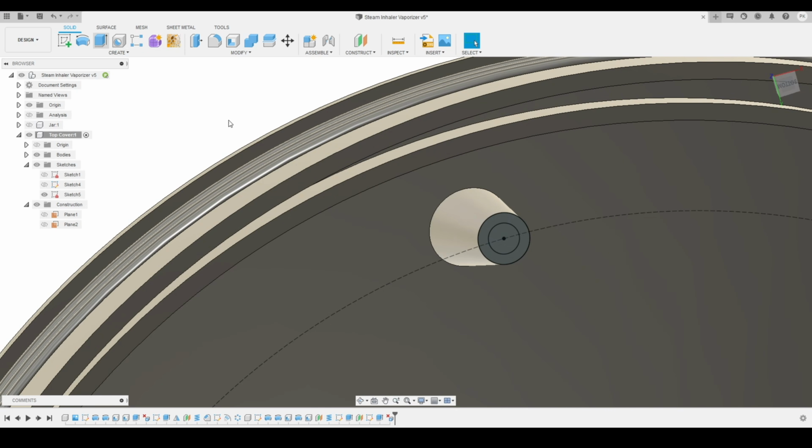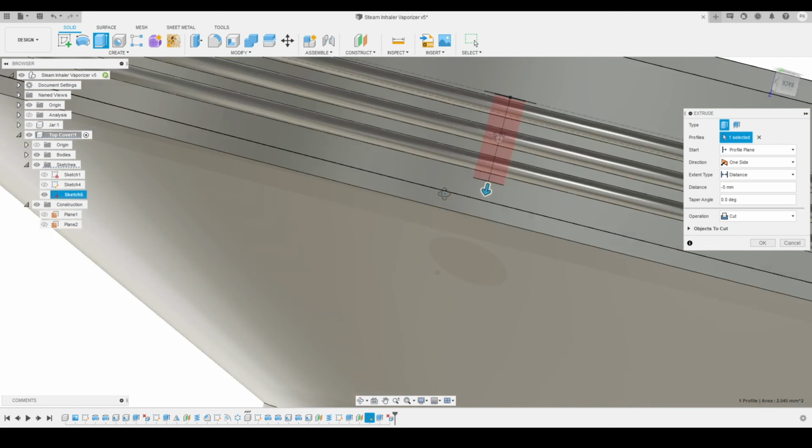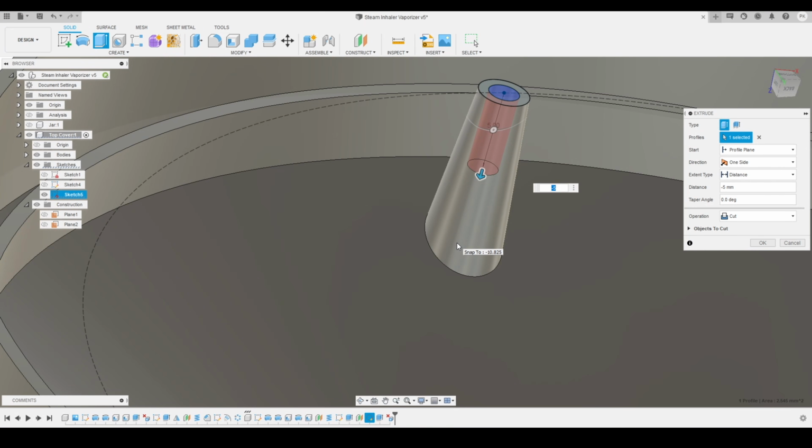We'll activate the extrude tool. We'll select this profile and extrude it towards -5 millimeters. I think I had to increase it a little bit more, so I will write -8 millimeters, and I will change the taper angle over here to -5. I think -5 is a little higher, so I will change it back to -3. So -3 is looking good, and I will press OK to accept the results.